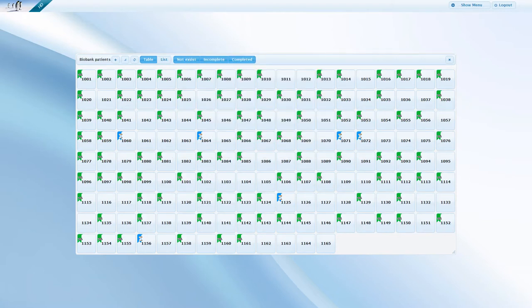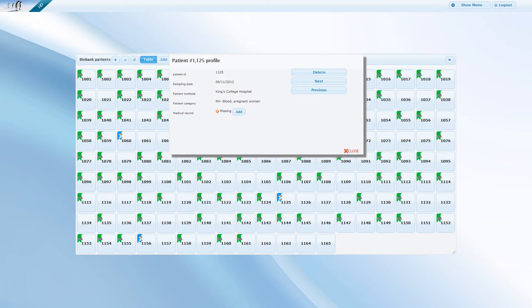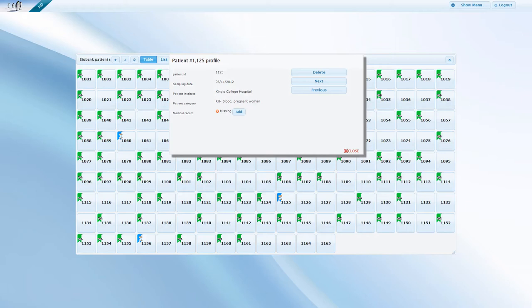Now, to carry on with entering the data from here, click on the newly created identification number. The appearing profile window provides you with information about the location and the patient category. This is where you can delete the patient or you can jump to the next or the previous patient if needed.